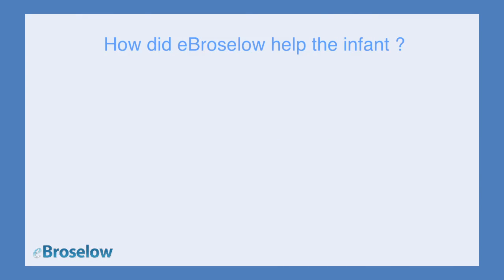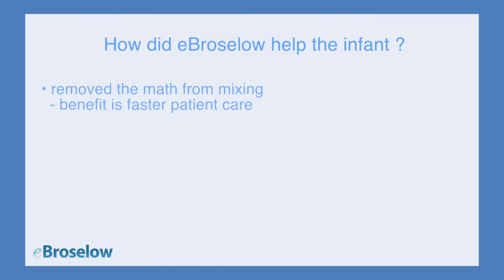And how did eBroselow help our infant? First, eBroselow took the complex math out of mixing the alprostadil infusion. The patient was in an emergent situation and did not have to wait for pharmacy to send the medication. The benefit is that treatment began immediately.